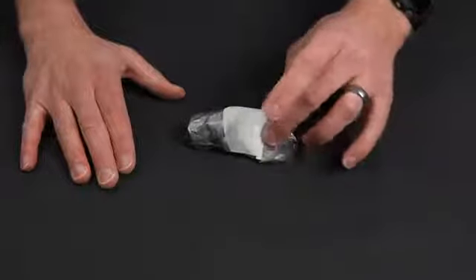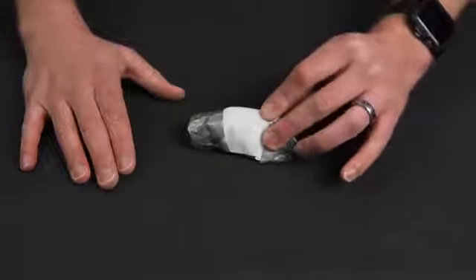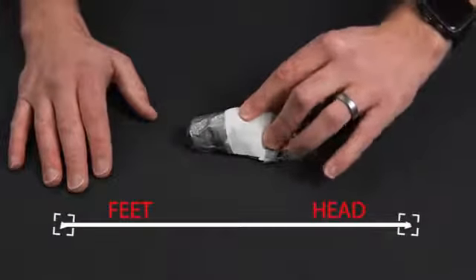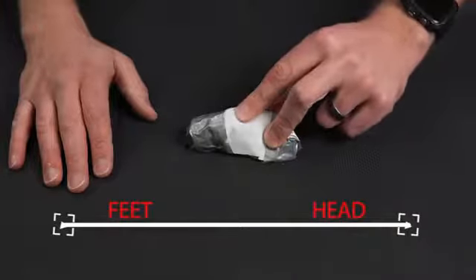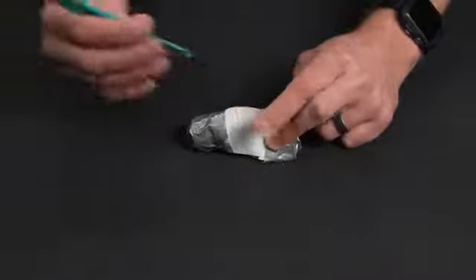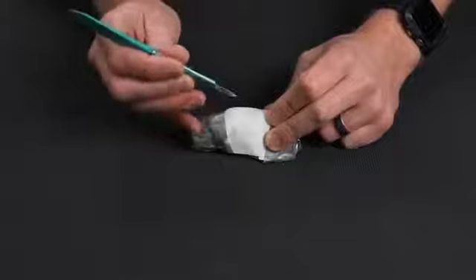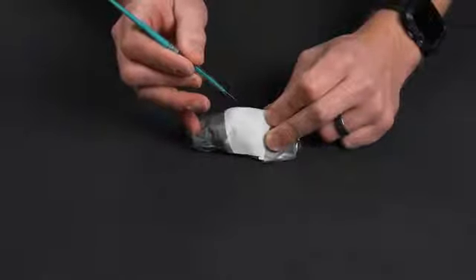We're going to find the thyroid cartilage here, and I'm going to palpate the prominence, or the Adam's apple, with my pointer finger, slide down and find my landmark for the cricothyrotomy, the cricothyroid membrane right here. I'm then going to take my scalpel, and instead of making a first incision through the skin and a second incision through the membrane, this one is one incision through the membrane and the skin at the same time.